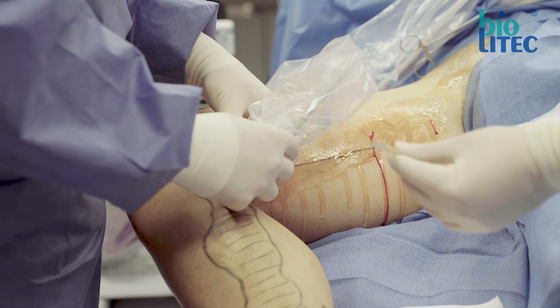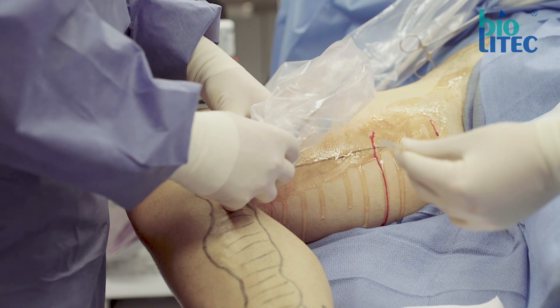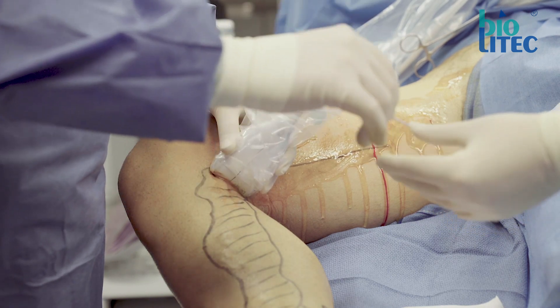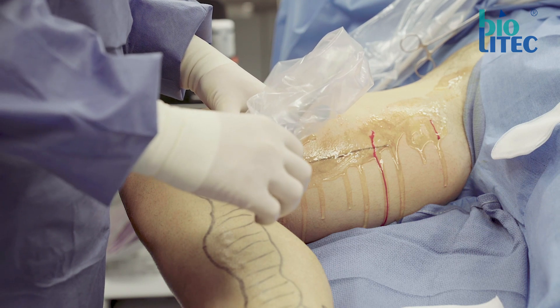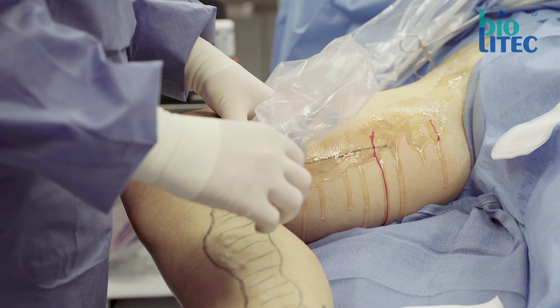My advice is to avoid the region around the knee and just above the ankle if possible, because due to the bone the free range for manipulating the needle is often too limited.